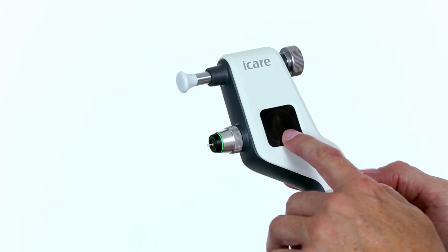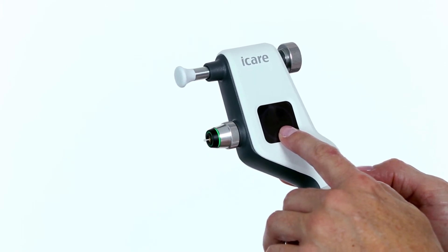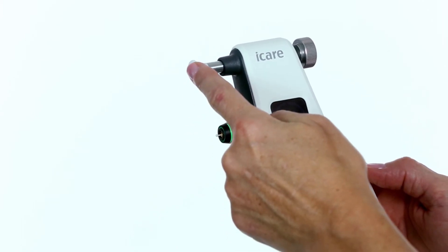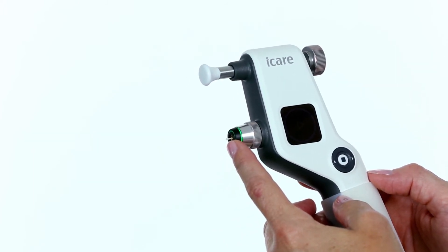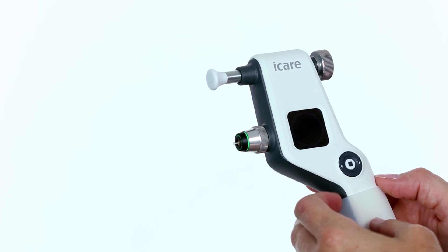The tonometer is ready to take a measurement when the blue play symbol appears on the display. Place the forehead support on the patient's forehead. Aim the probe in the center of the eye and the distance of the probe to the cornea should be 4 to 8 millimeters.